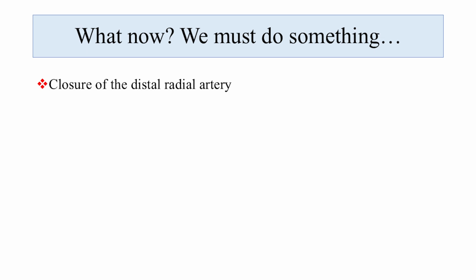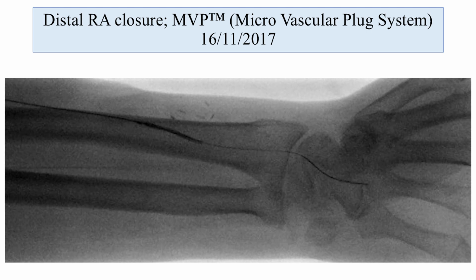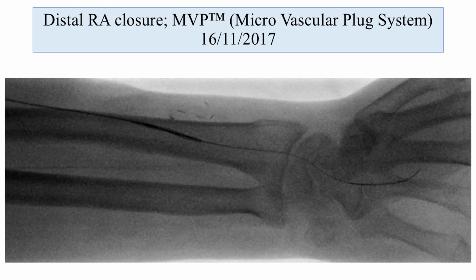I don't like closure of the arteries, but the only other option is closure of the fistula, and I'm not going to take this option. Thus, we occluded the radial artery using microvascular plug system.